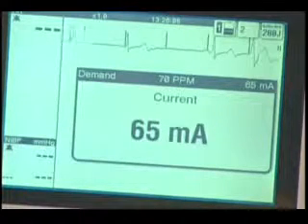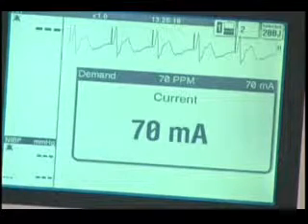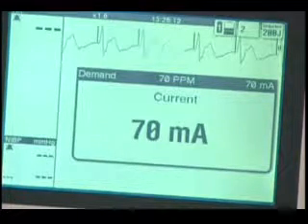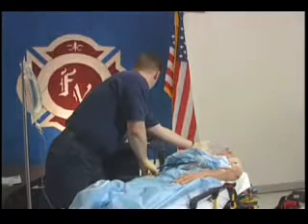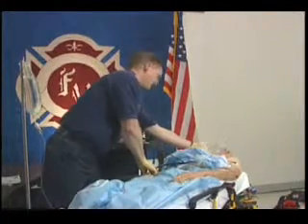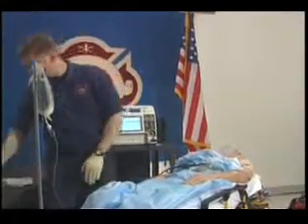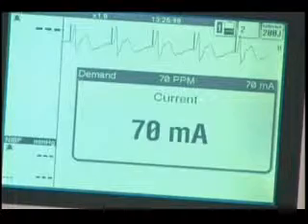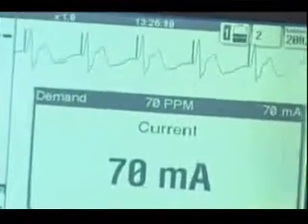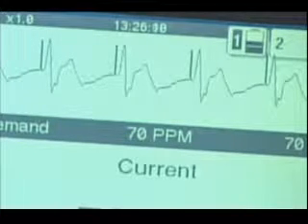Begin with 50 milliamps. Often, for a patient with a perfusing rhythm, capture will occur in the range of 55 to 70 milliamps. If the rhythm is asystole, some medical directors will suggest selecting the highest energy level and then dialing back. Always follow your local protocols. When capture is achieved, a wide QRS preceded by a pacer spike should be observed at the rate you've selected. Chest muscle contractions may also be seen at that rate.